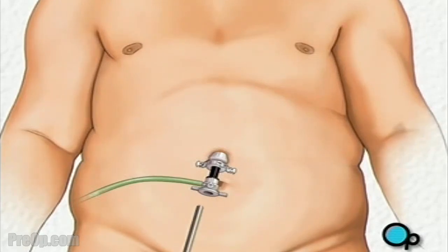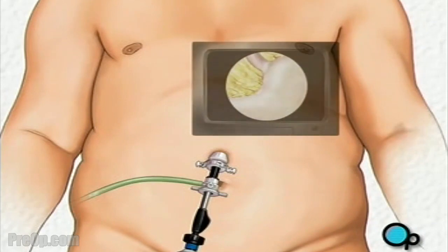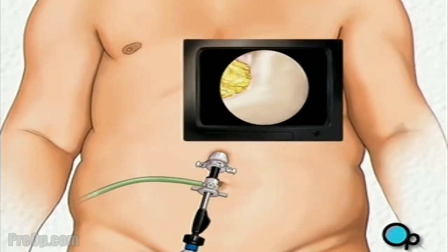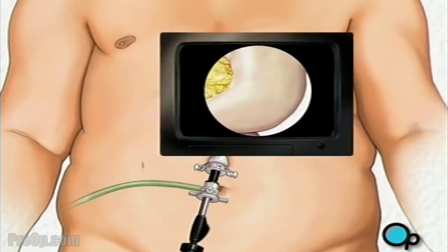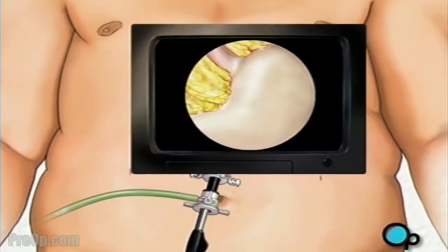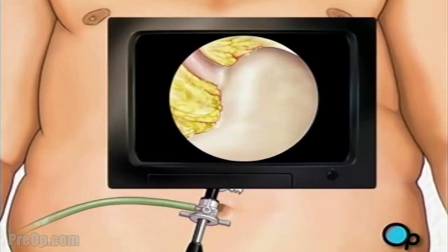The team then inserts the laparoscope. Once in place, the laparoscope will provide video images that allow the surgeon to see the inside of your abdomen. Next, the team makes four more incisions, taking special care to keep the openings as small as possible. These openings will provide access for other surgical instruments.